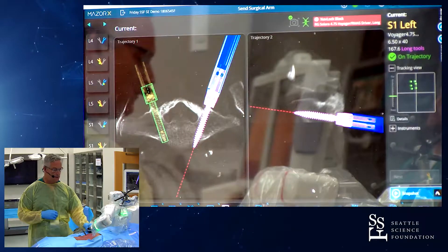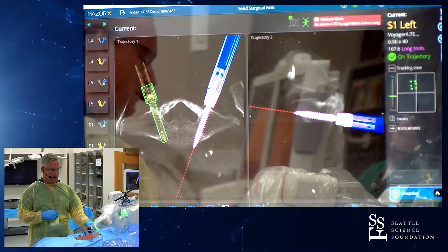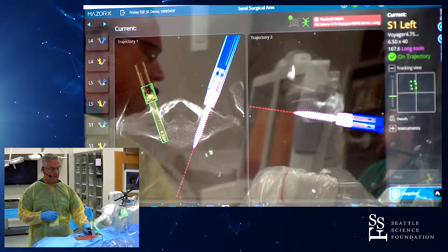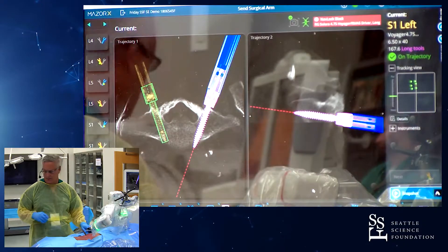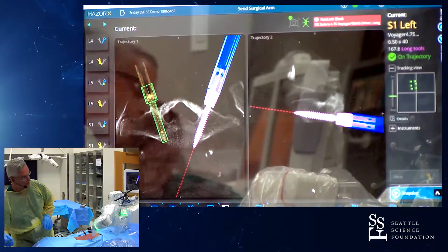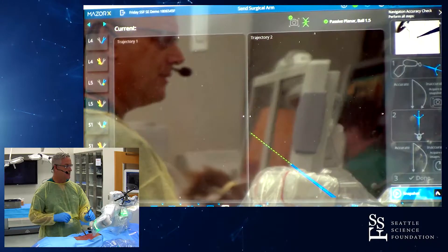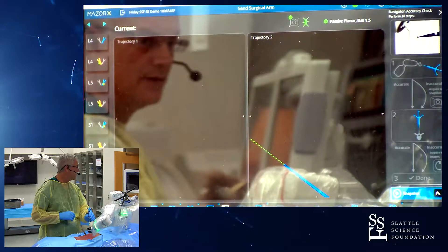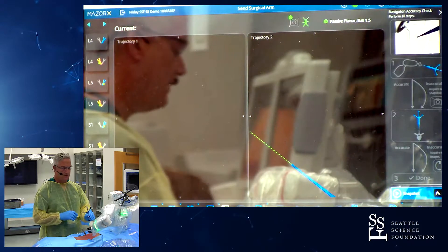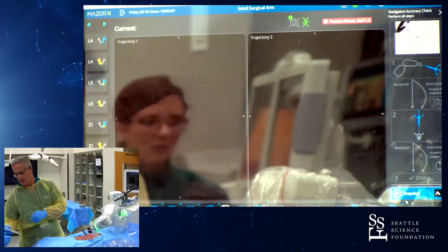When you use Stealth and the robotic arm separately, you have a redundant safety system because you're able to check the accuracy of your robot with your image guidance. With the combined approach, you can check accuracy using any of your hardware. If you take the blunt probe, you can check the accuracy of the end effector based on your image guidance. Looking at the upper right-hand portion of the screen, you can see that the pointer aligns with the divot. If it were off, you can re-register your nav without scanning again.